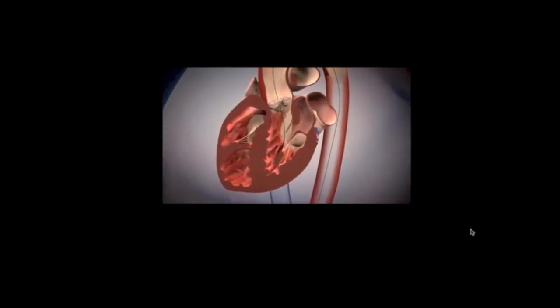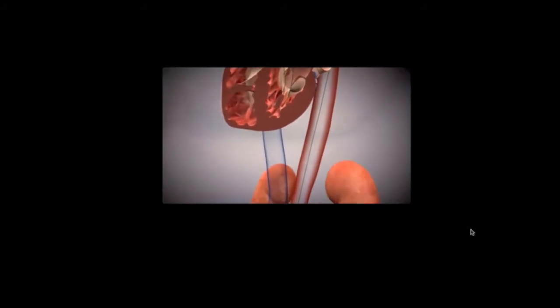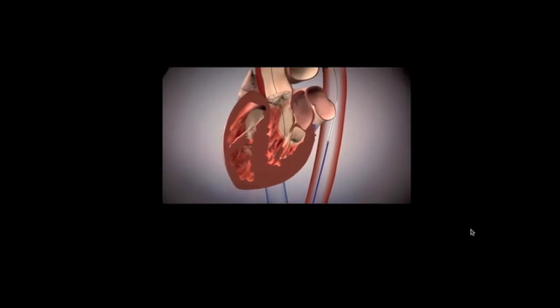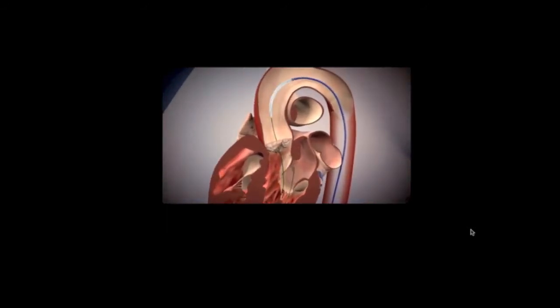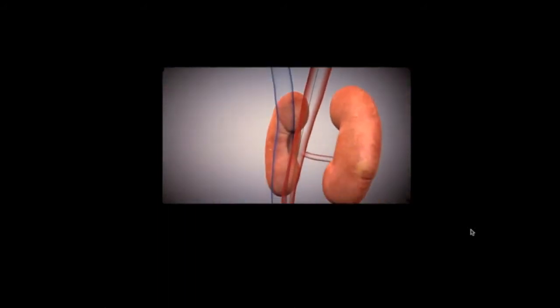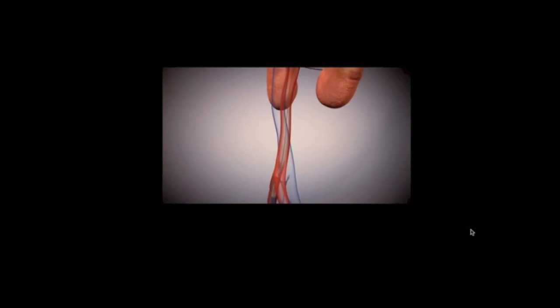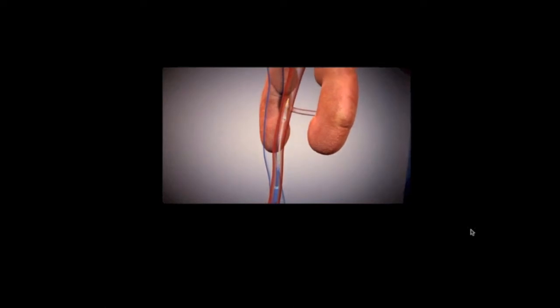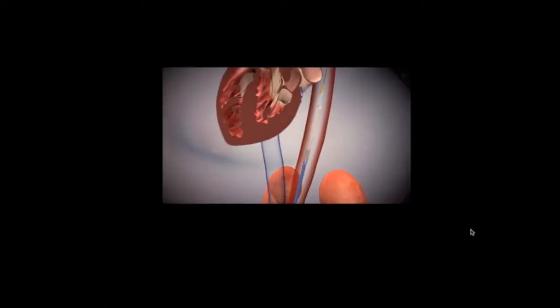As you can see here, we're bringing a wire up into the heart and across the diseased valve, and we curl that wire up into the main pumping chamber of the heart called the left ventricle. From there, a regular balloon catheter is brought in, and we expand that balloon across the native valve. This is really to give us a little working room to place the larger stented valve across the aorta. That's called a balloon valvuloplasty, a technique that we've had for about 20 years, but is not very durable in and of itself.